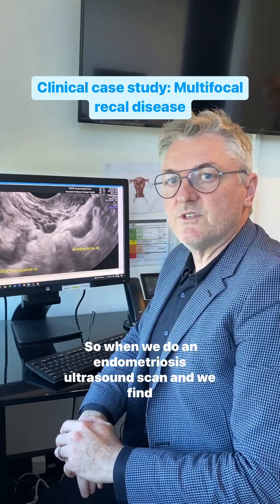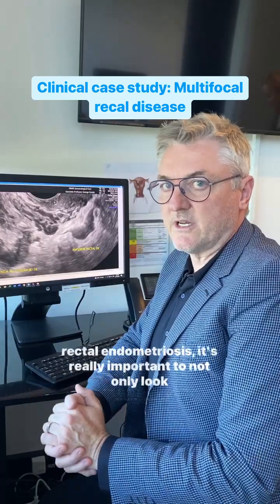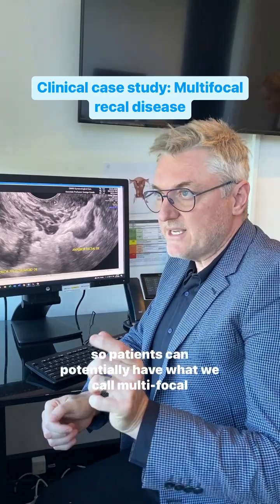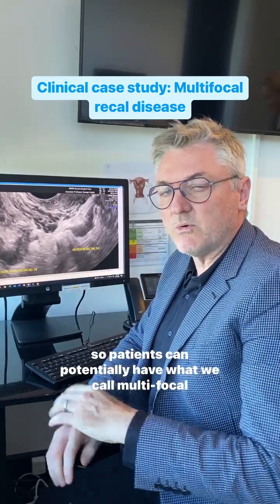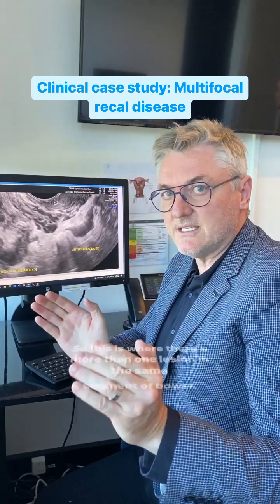So when we do an endometriosis ultrasound scan and we find rectal endometriosis, it's really important to not only look at the lesion that we can see, but also look above that. Patients can potentially have what we call multifocal disease. This is where there's more than one lesion in the same segment of bowel.